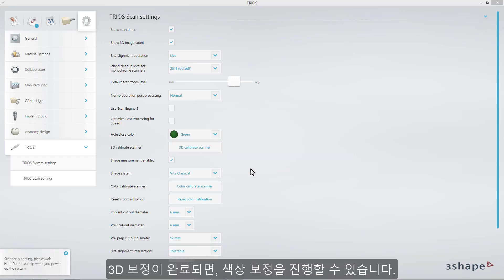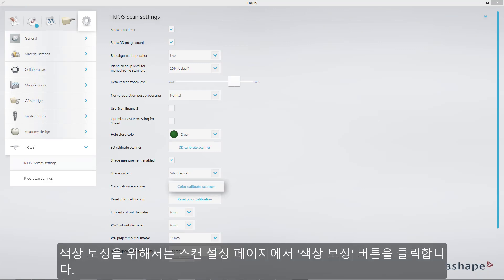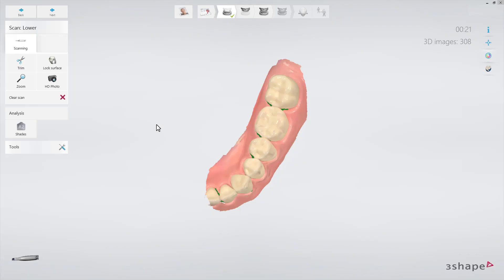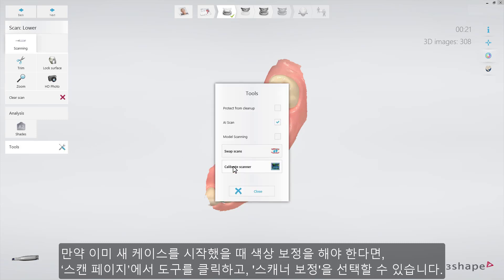As soon as 3D calibration is completed, you can proceed with color calibration. In order to color calibrate, press the button Color Calibration on the Scan Settings page. Alternatively, if you need to perform color calibration when you have already begun working on a new order, this option is available on the Scanning page under Tools Calibration.